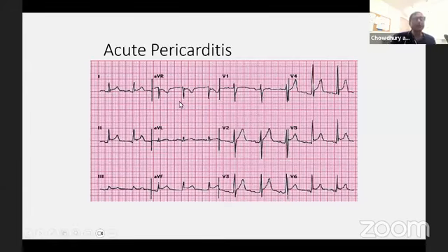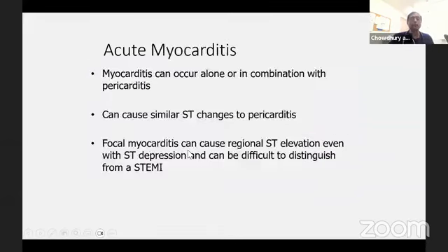But what is helpful, I have seen that if a bedside ultrasound shows hyperdynamic LV or normal LV, no wall motion abnormality, because in transmural MI the LV wall motion gives you a clue. It is the subendocardial ischemia, non-STEMI, where subendocardial ischemia without transmural MI can give you normal wall motion. So in that case, it may not be that helpful.